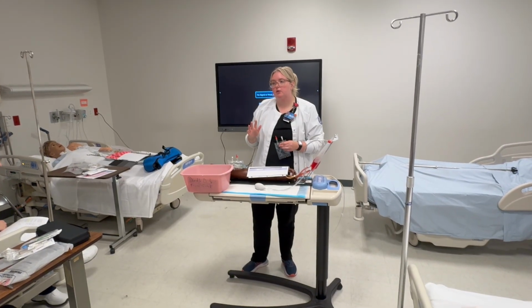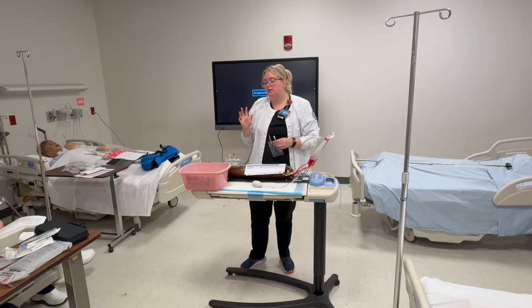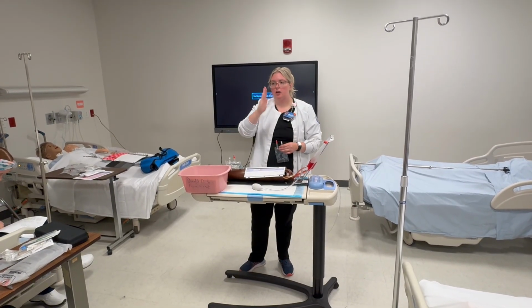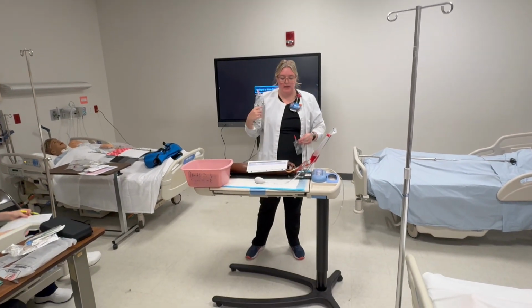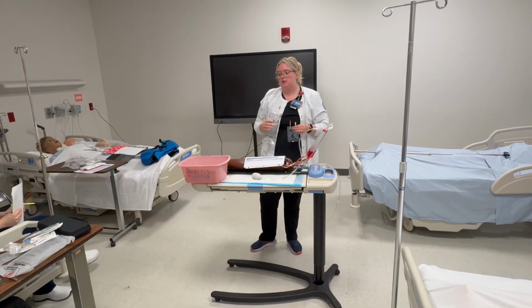So that's going to take a while. Your checkoff is going to be repeating that, and you need to do that every time. This is something that, not you guys, but in previous semesters, everyone messes up. They want to try to go across the board: I've got my right patient, John Smith. I've got normal saline, and I've got gentamicin. No, one at a time, all 6 rights, okay?